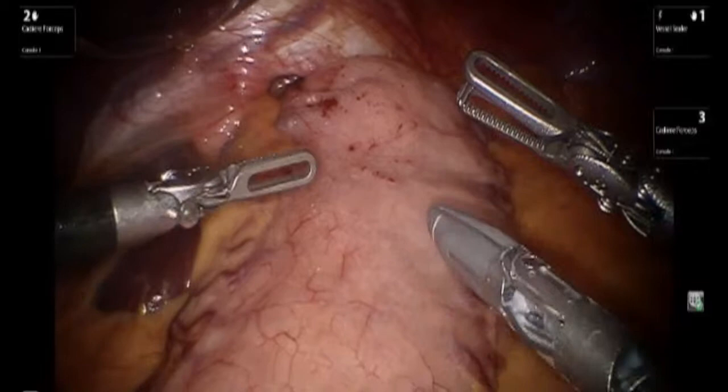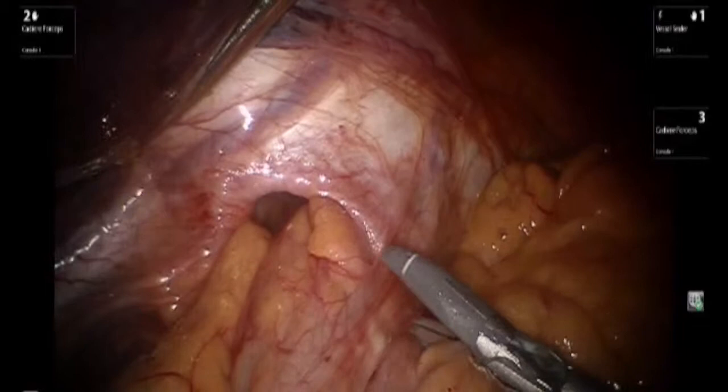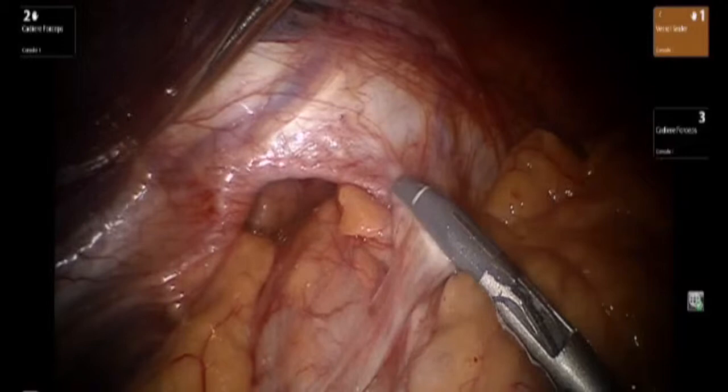We present a robotic hiatal hernia repair with use of biologic mesh and a Toupet fundoplication. The patient was noted to have a hiatal hernia that contained the upper one-third of the stomach.